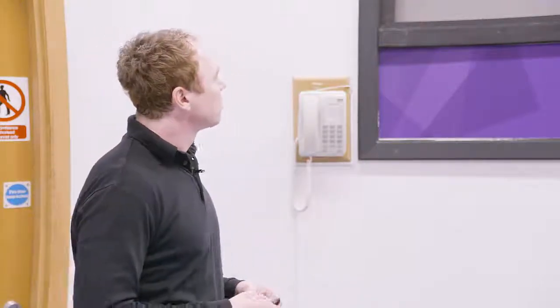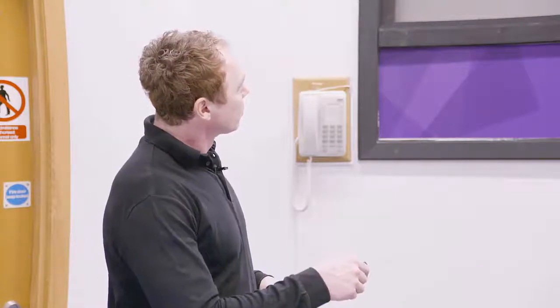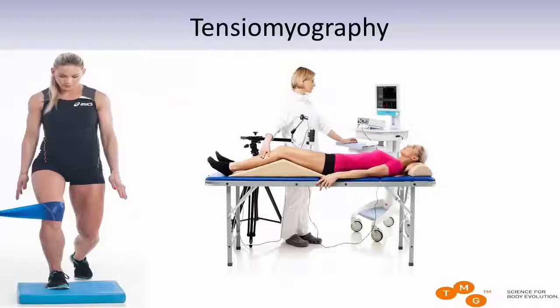With the same criteria. For the sensor to be held in the right position, we use the camera tripod with a mechanical arm which positions and holds the sensor over the muscle during the contraction. And that's it. So you obviously don't need this medical card, but the whole system is portable. It is frequently used. It's not meant only for laboratory use. It is frequently used in the pitch, on the track.